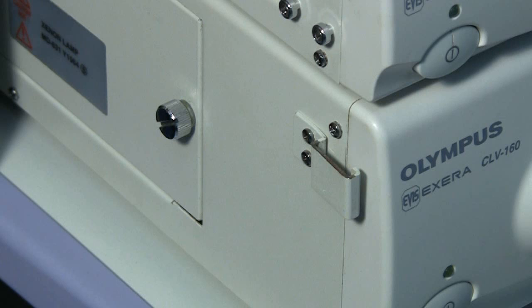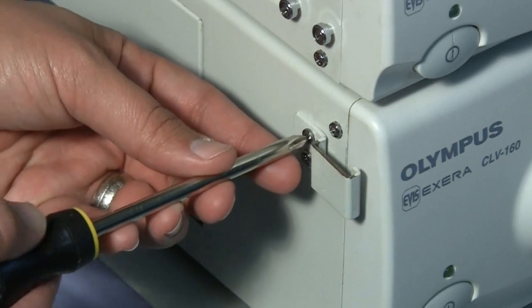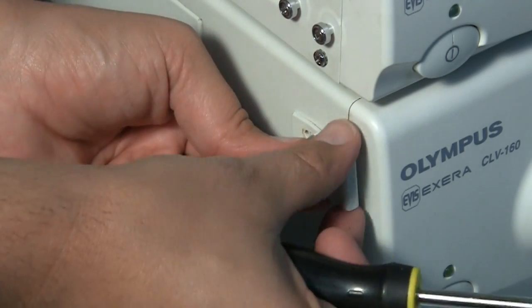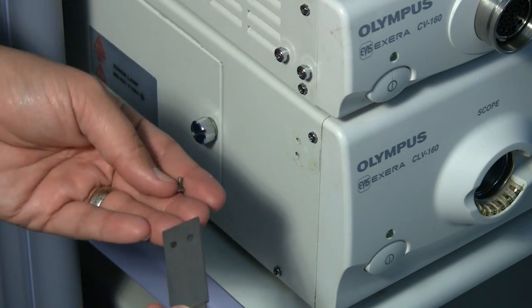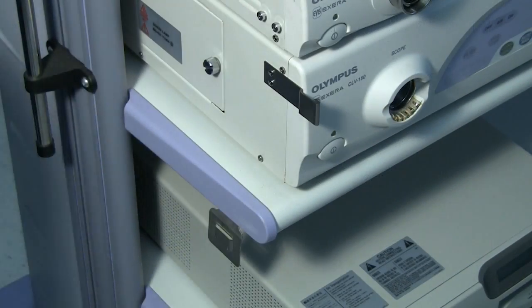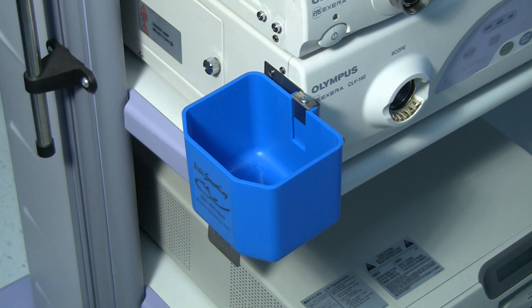For these issues, each water bottle holder comes with an extension clip. To attach, use a Phillips head screwdriver and unscrew the screws holding the original clip in place. Make sure not to lose the two screws as they will be used again shortly. Fully remove the original clip and set it to the side. Next, with the original screws, attach the new extender clip to the processor. Once nicely tightened, you are now ready to attach the water bottle holder. Note, this is not a permanent change and the original connector can be reattached if needed.